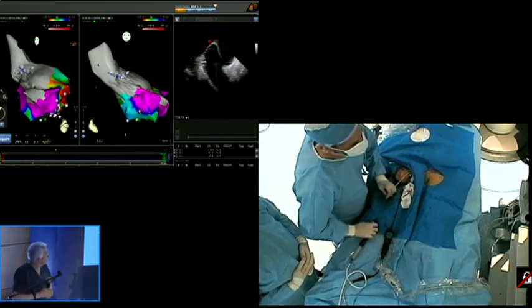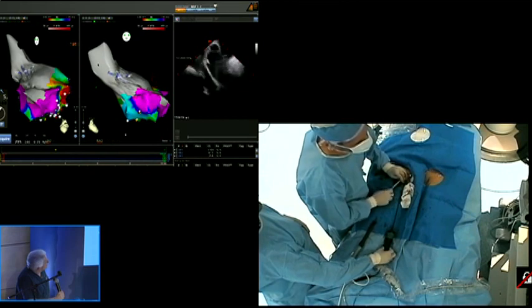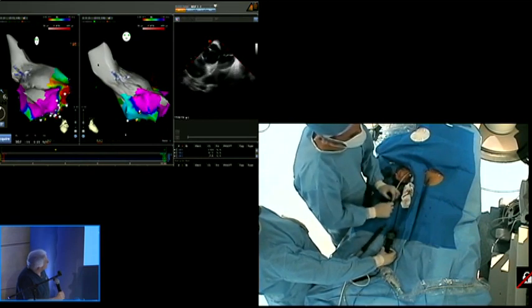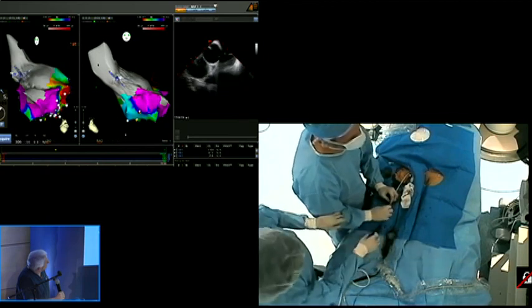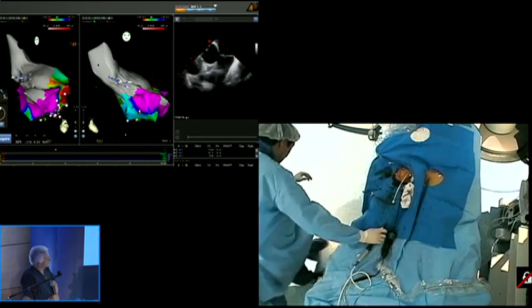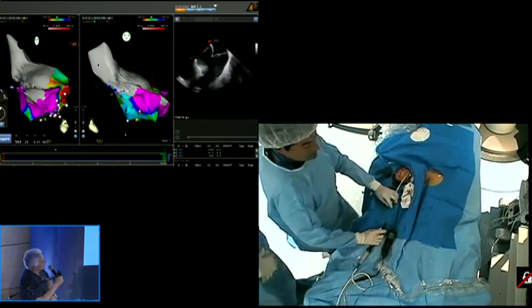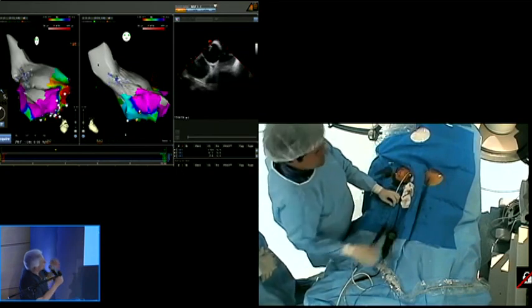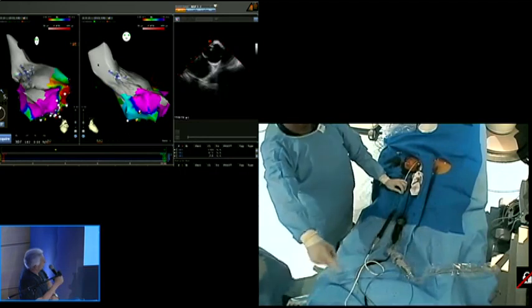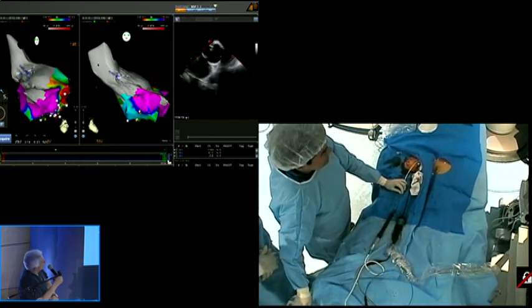All right. Let's get a lead, and I'll have to cross with. Oh. Yes, sorry. So Luis has the lead. Okay, good. Can we get a pentaray page? Can you show the floor? Yeah, it's coming. It's coming.